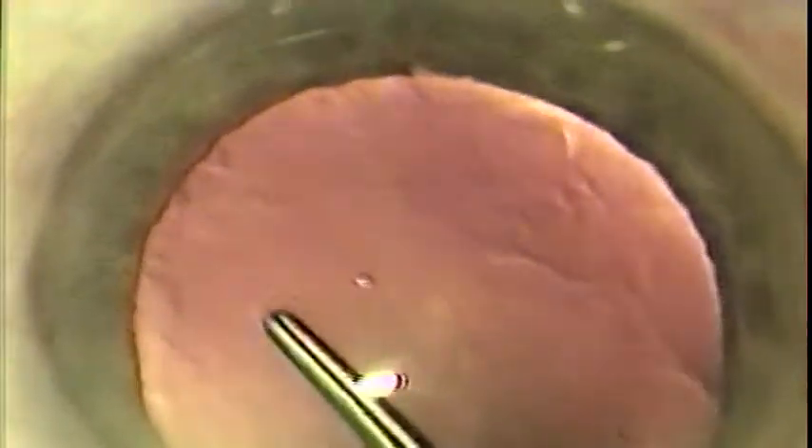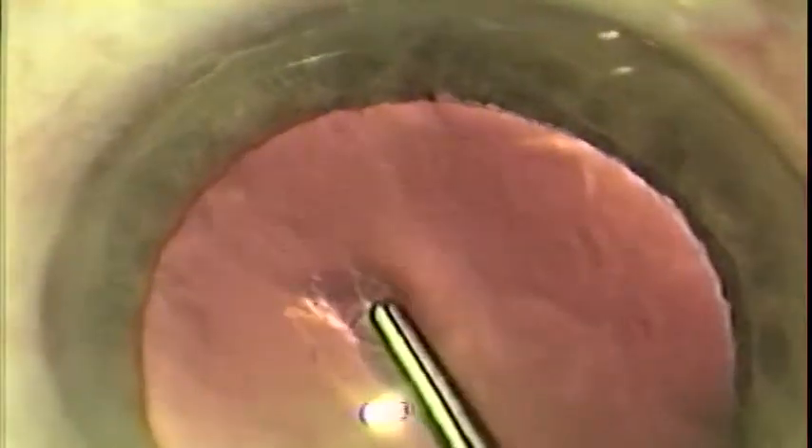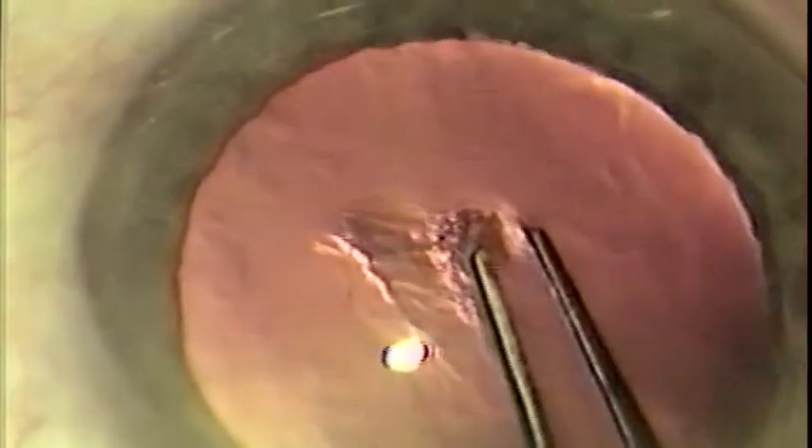The first maneuver is a pinch of the anterior lens capsule, thus opening it. The tips do not function like a cystotome in the sense that they do not puncture the capsule, but rather snag it, creating the tear with a smooth edge, avoiding puncture marks that can lead to uncontrolled equatorial tears.